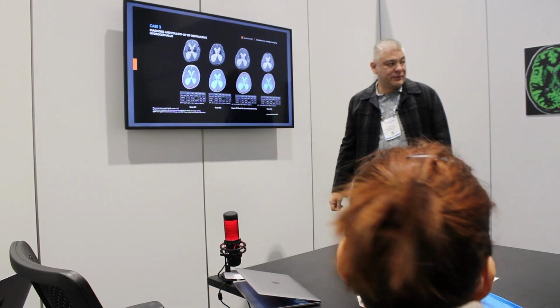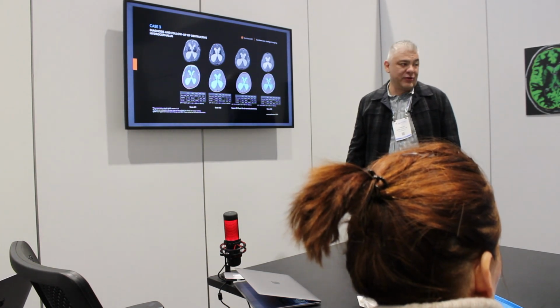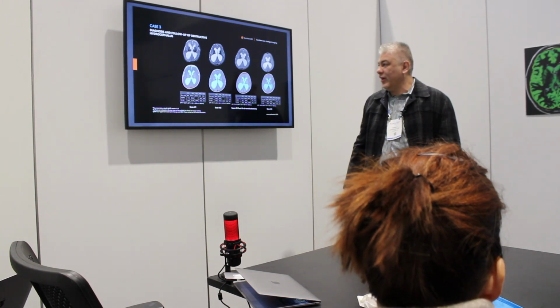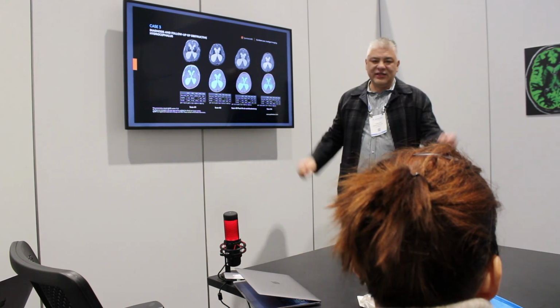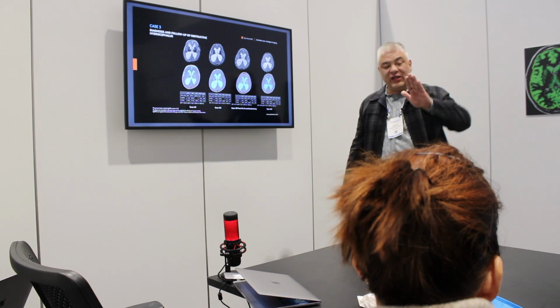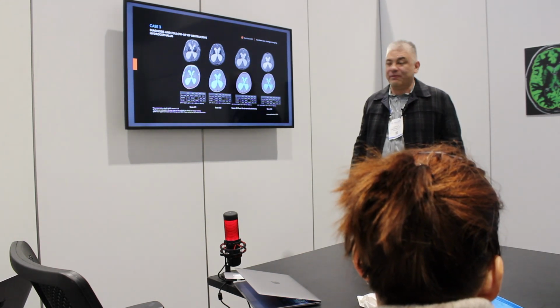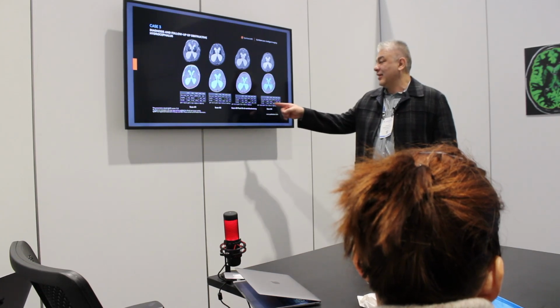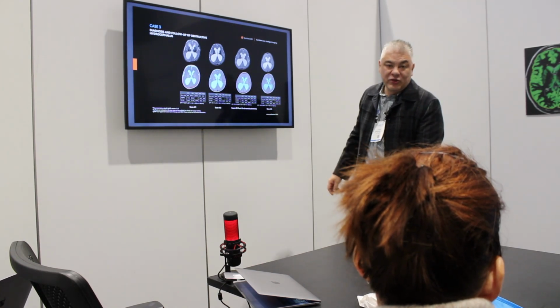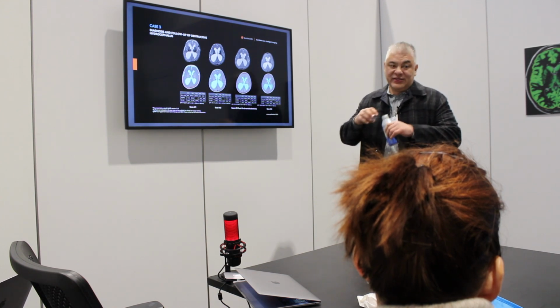Yeah. Can I ask another question? Does head angle also confuse you guys when you're... Absolutely. He has a good point. Sometimes when we have to look at this and start measuring, let's say, if the ventricles are bigger or smaller, the angle of the cut can be different, and that can also be altering our perception. But now that doesn't matter because we have numbers, so we know exactly how much more or how much less CSF there is.